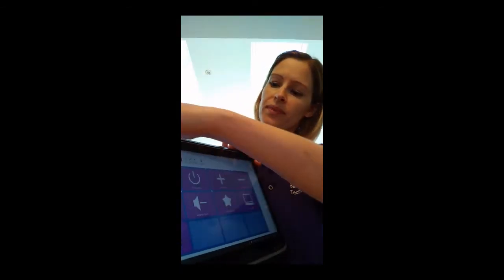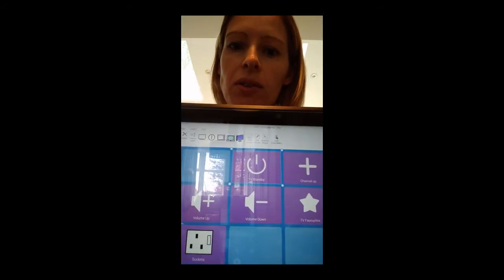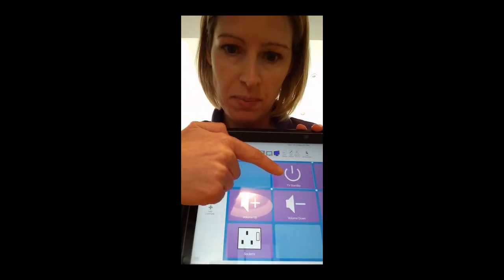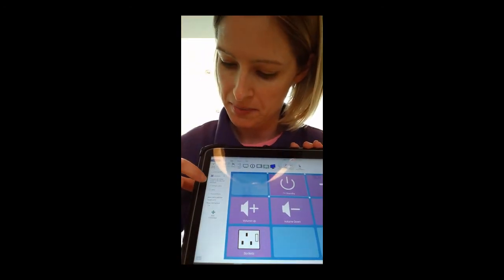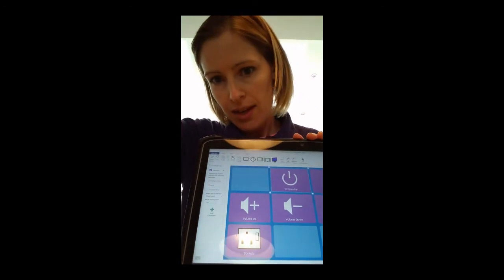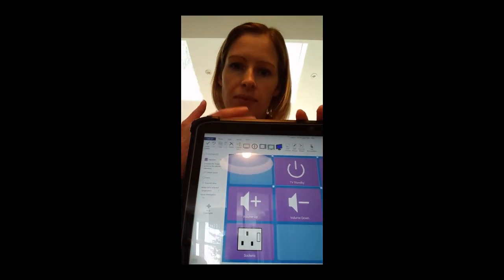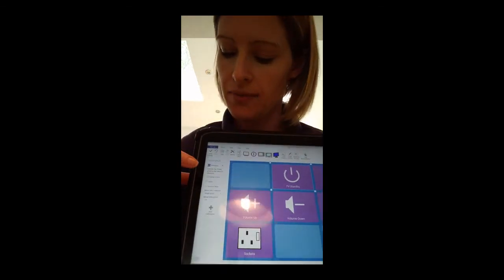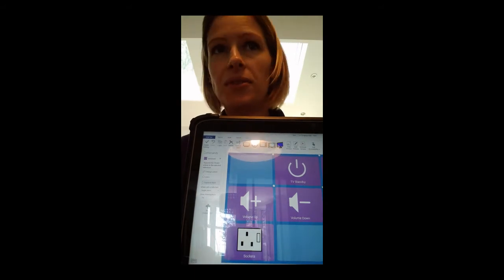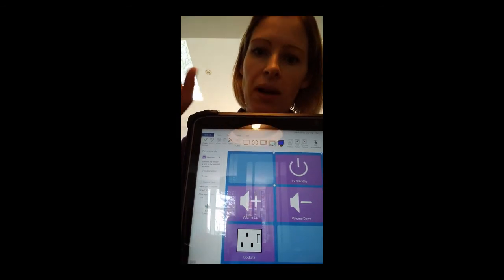Once you've recorded a button, looking back at your screen, you're able to test whether that works with your TV. The button we just did was the power button. Instead of pressing Learn, you can press Transmit Now. To make sure it's working, sit in front of your TV with the Grid Pad facing you and the back of it towards the TV, then press the Transmit Now button. If it's working, it should turn your TV on or off. If it doesn't seem to work, you can just record it again and go back through the process.